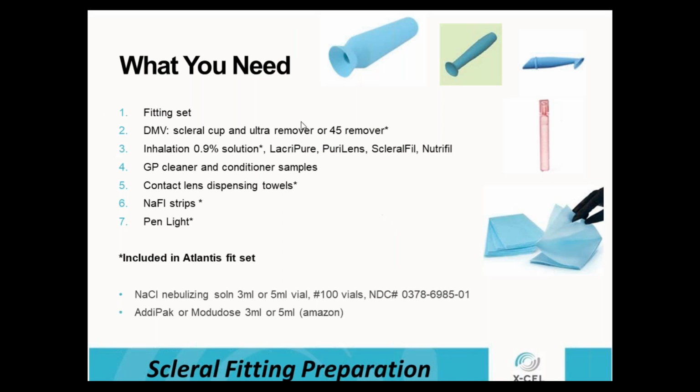If you're using the fit set and it is in a dry state and you know you're going to have a patient the next day, I would recommend that you hydrate and put some lenses in a conditioning solution to have them wet. When we take a lens that's in a dry state from a fitting set and we try to apply that lens even after cleaning it, you will see a front surface not wetting a lot of times. We want to really condition that lens and get it hydrated, even though it is a GP lens and it's not really absorbing that conditioning solution.